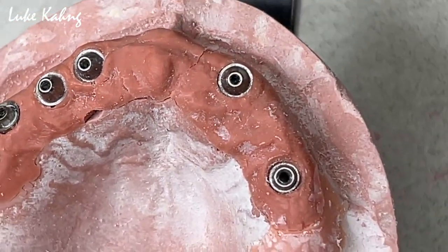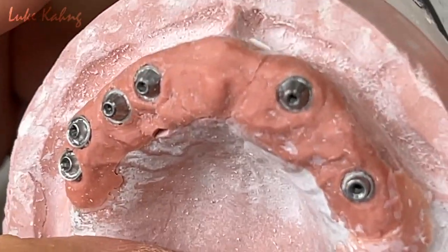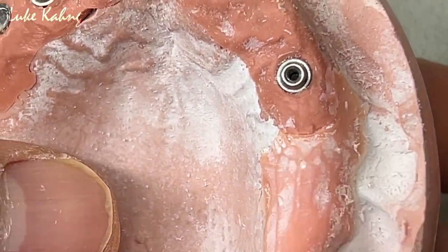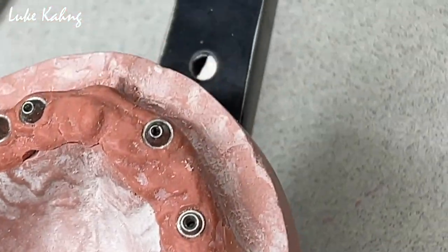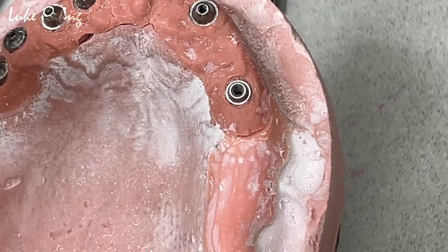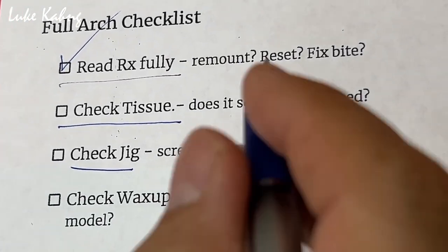Tissue is a very sensitive matter, because some tissue you don't have to grind a lot. This is really good. Very gently touch it — just a tiny bit. Then we can fit it. After that, I'm going to check the tissue. Check jig — it's very important too. The doctor already did it, and it sits all the time. Good.